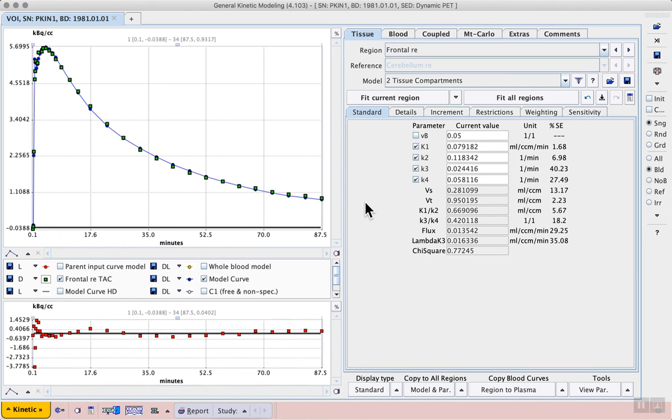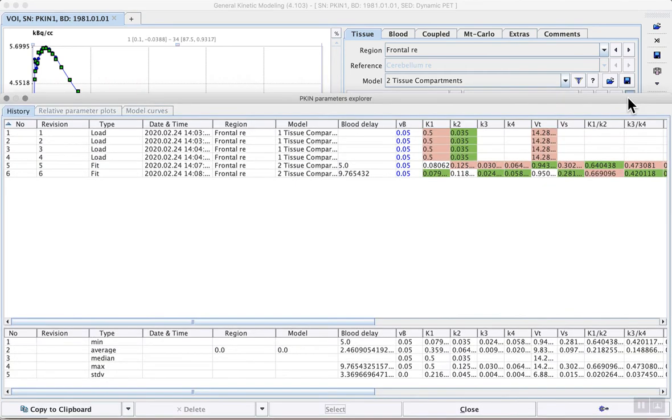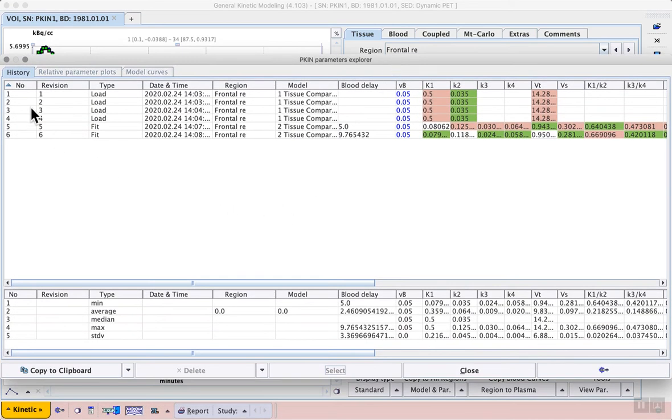Back on the tissue tab, the changes of the parameters using the different fitting options are best inspected using the show history button. Here we see a number of revisions of the model fit.